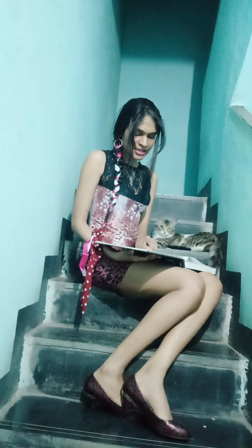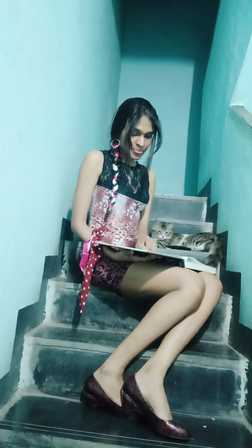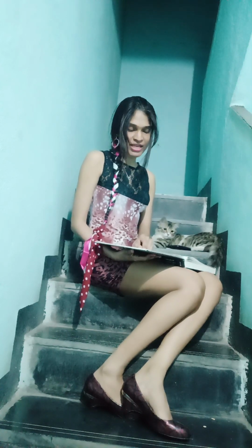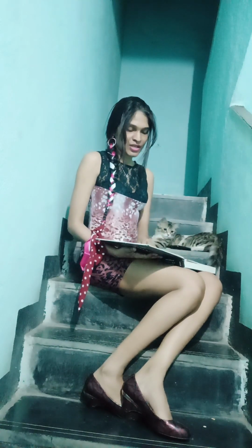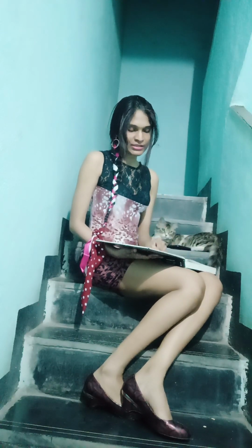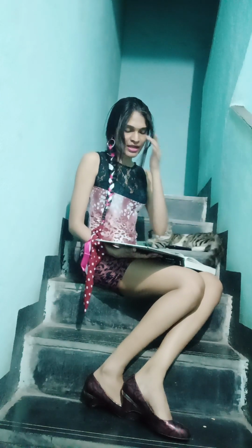Okay, and then you can see here there is a contact lens and air interface. But as the anterior curvature of the lens is steeper than the corneal curvature, the angle of incidence is less than the critical angle here for the contact lens and air interface, and the rays are refracted into the rarer medium, that is air, and can reach the examiner's eyes to see the anterior chamber angle.